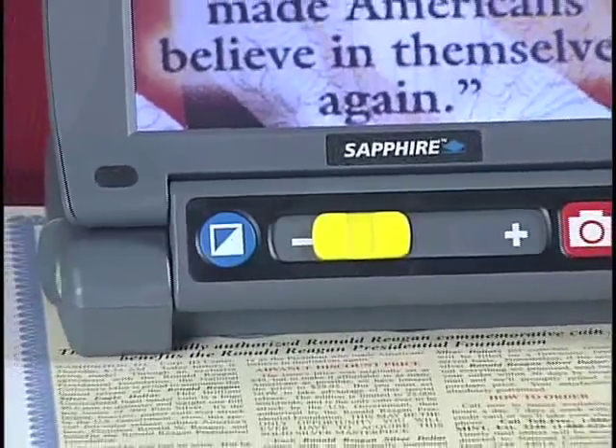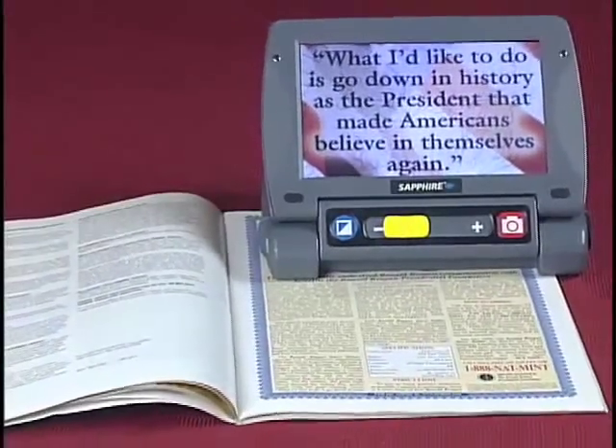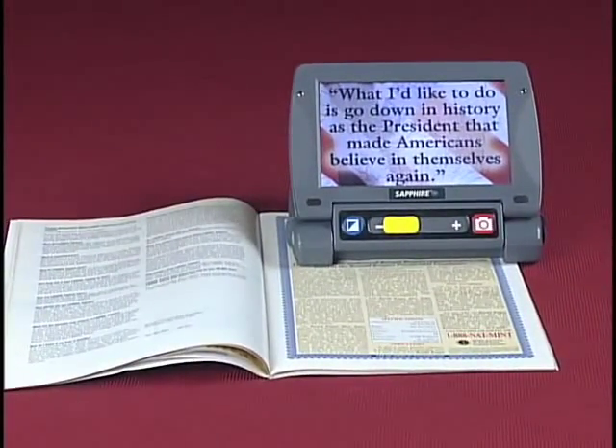Hello, I'm Charlie from Freedom Scientific, and I'd like to show you a new portable video magnifier that people with low vision like me use when we're on the go and need some help reading or seeing the details of everyday items we come across throughout the day. It's the Sapphire from Freedom Scientific.